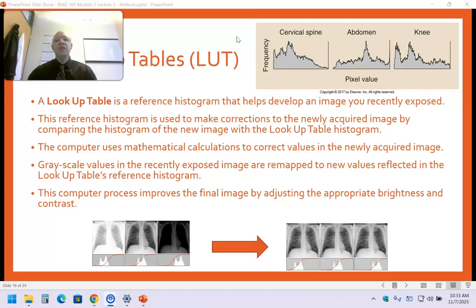There should be some collimation, so I need to be aware of that. I need to be aware of the edge of the exposed field. I also need to make sure that it's a high level of contrast because it's not an abdomen. I'm going to develop it with more bones and a little bit less with some soft tissue. And other than that, there should be nothing else involved.